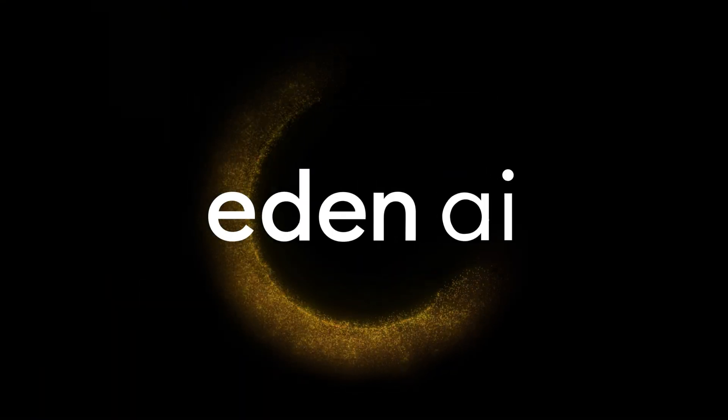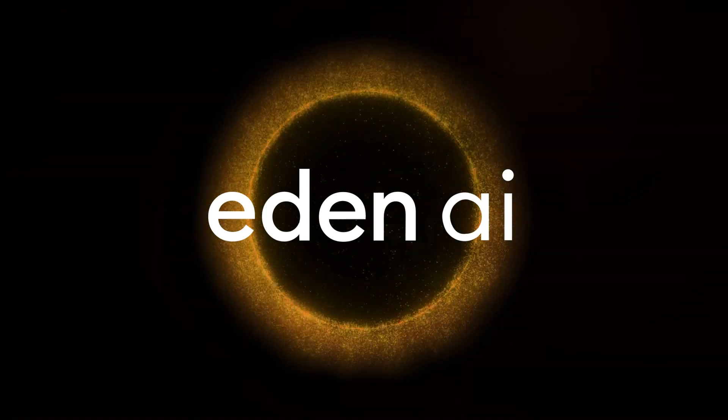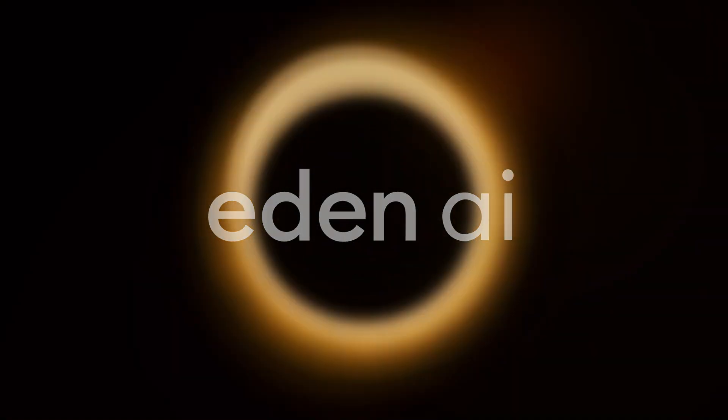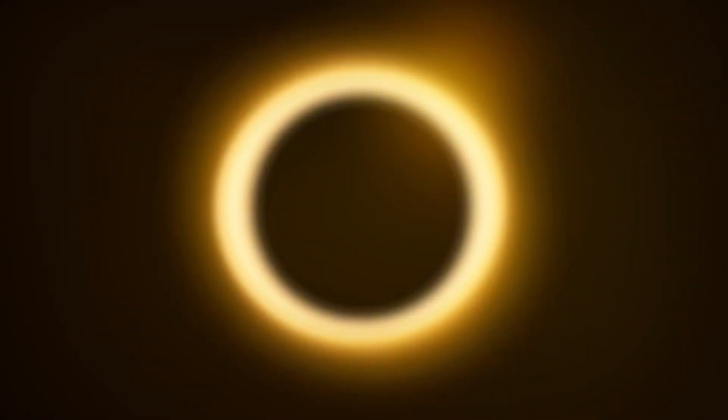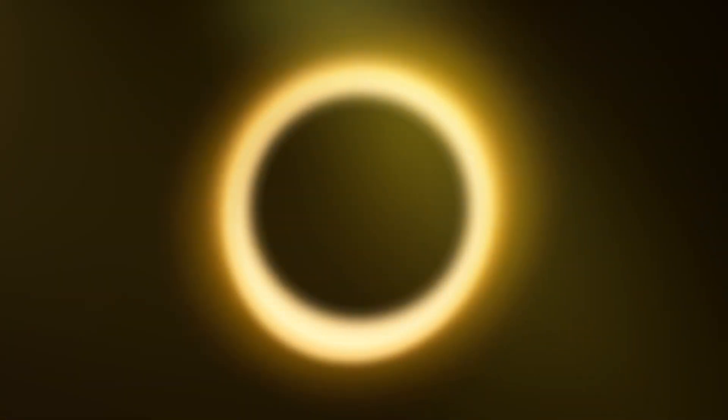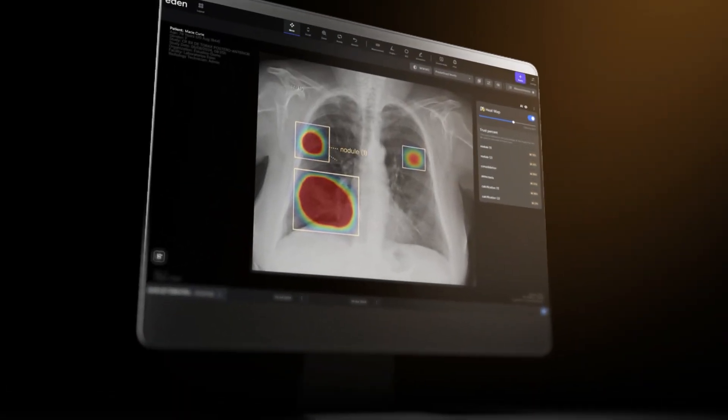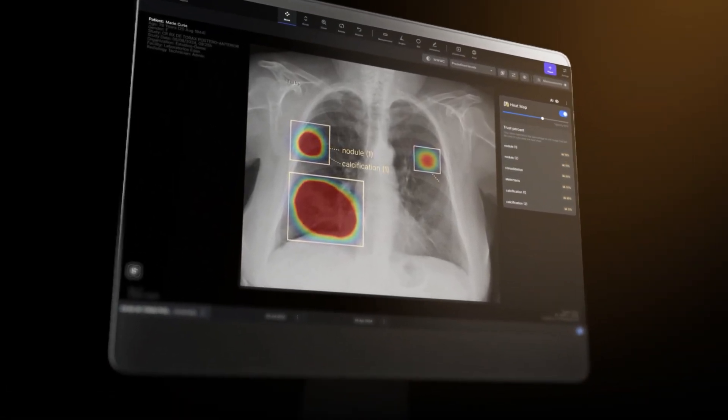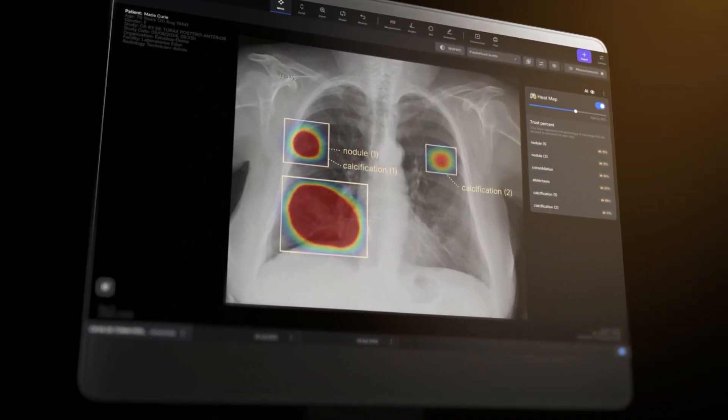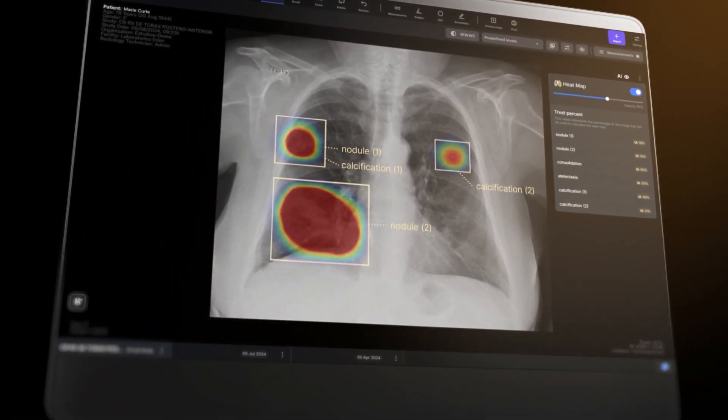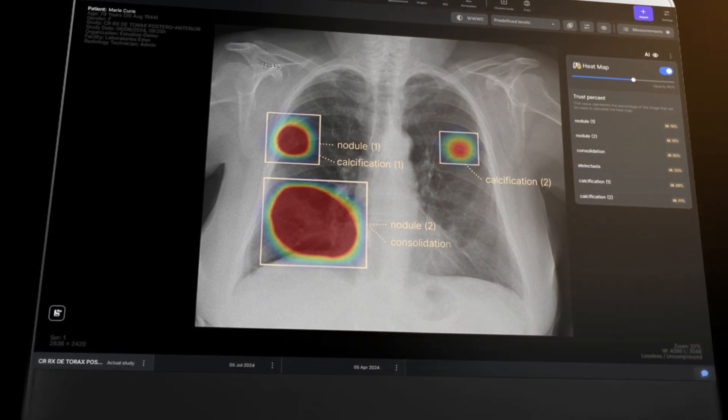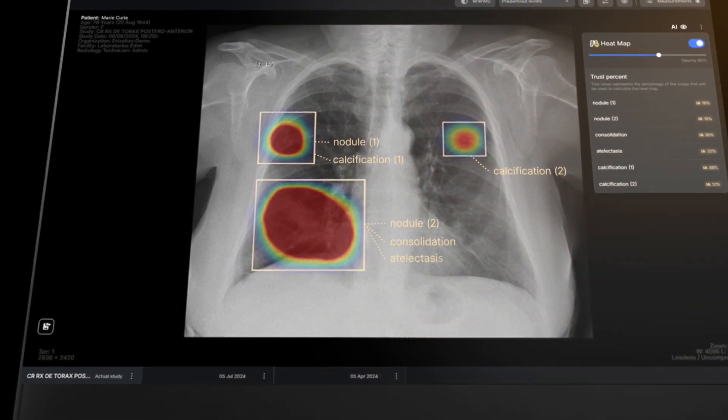Meet Eden AI Thorax, the first diagnostic artificial intelligence natively created within a PACS system, capable of detecting up to 10 types of thoracic findings, even before you begin interpretation.